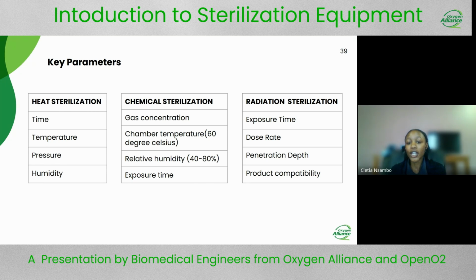If you misplace the settings, you might not have an effective sterilization, because the balance between your time and temperature is not there, and the temperature has not effectively killed the bacteria.